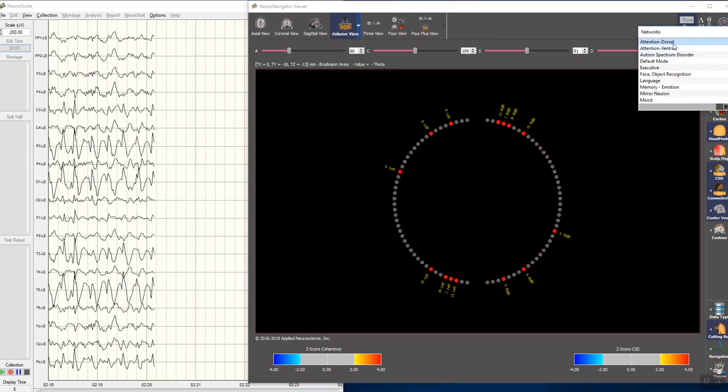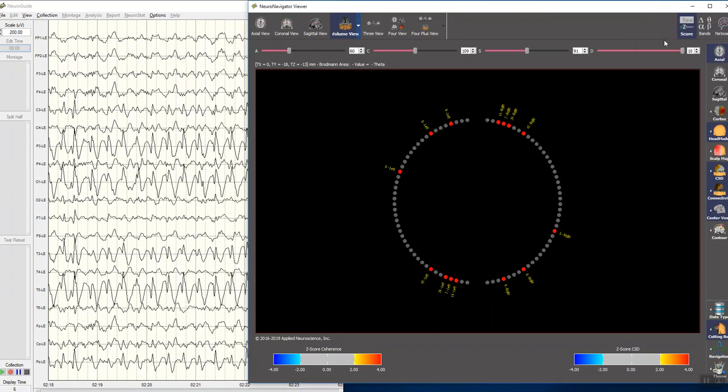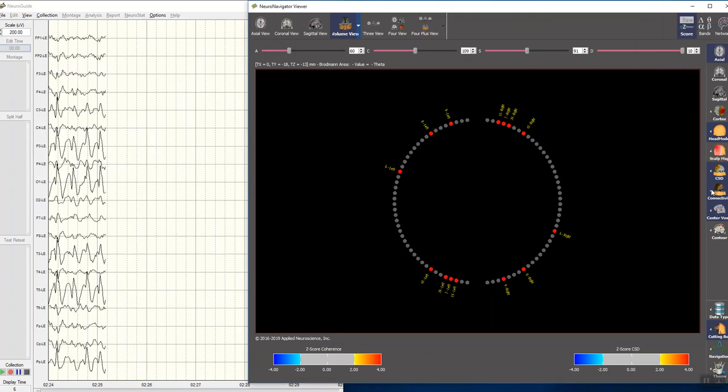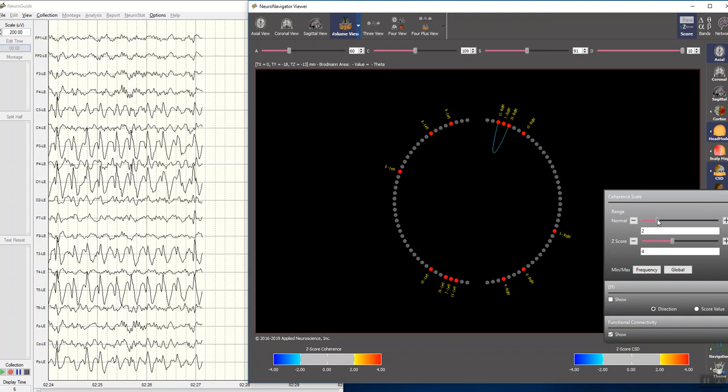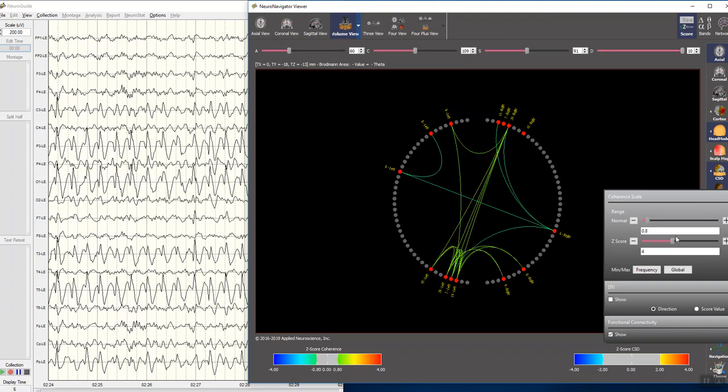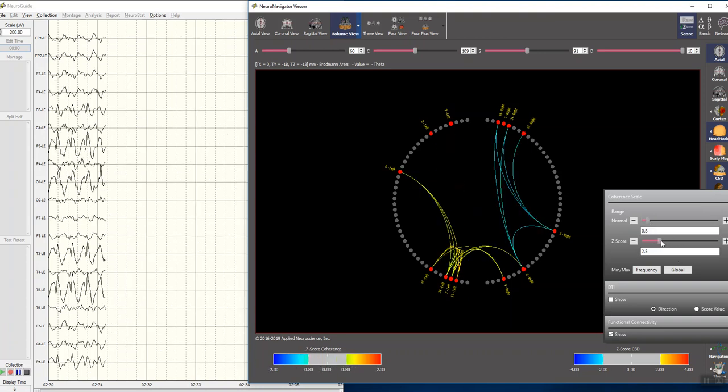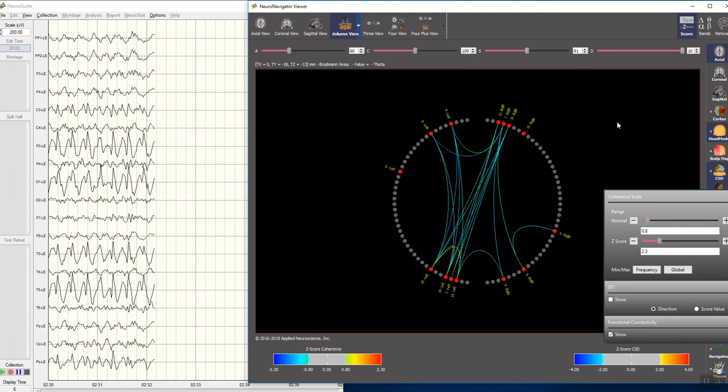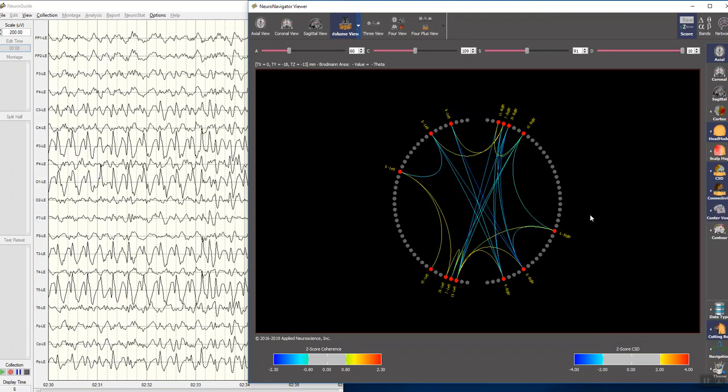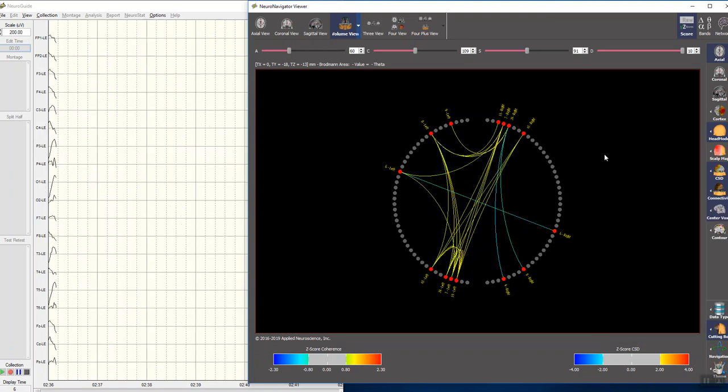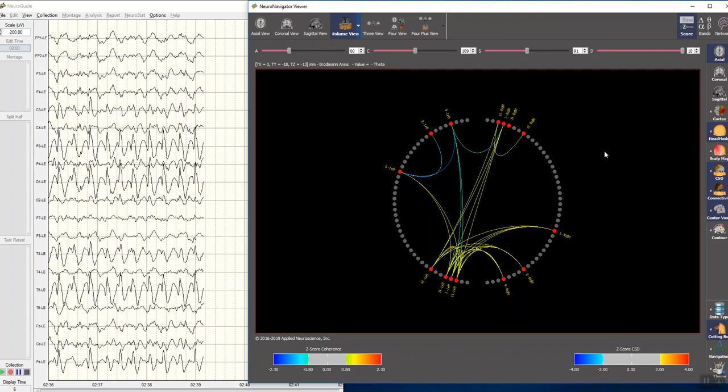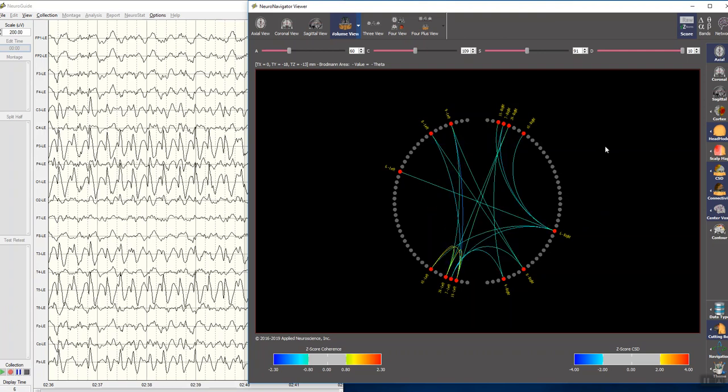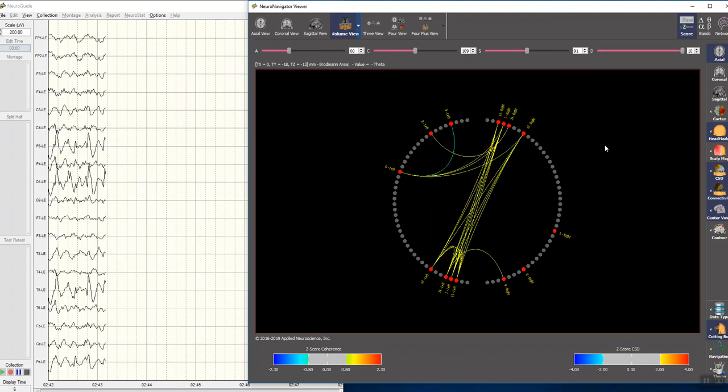Dorsal attention network. And I'll come here and set the z-scores so we can see the network come and go. And you'll be able to see in instances of time, in real time, which connections are within the normal range or within a given fixed value for the z-scores.